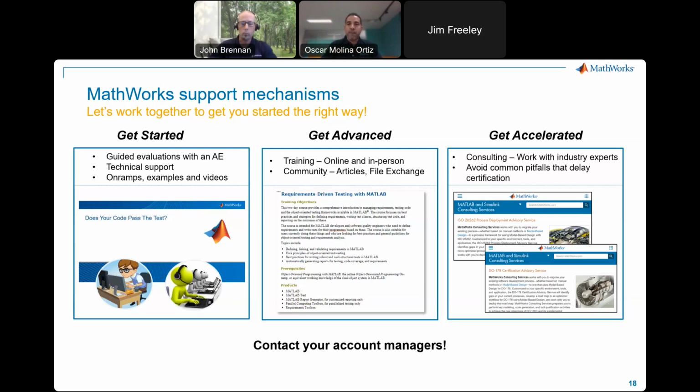Not only that, but also MATLAB... I don't know if you noticed, or I can share it very quickly. Let me do that. Just 1 second. But John, you're sharing your screen. Never mind. So MATLAB can actually connect with your Git repository, so that your code stays up to date all the time. So you connect your code with your Git repo, so that everything stays up to date directly by using MATLAB projects. So absolutely recommended, not only for MATLAB tests, but to manage your projects overall.